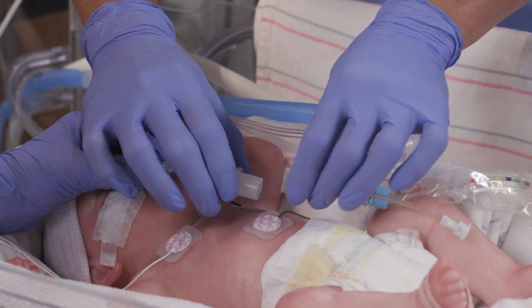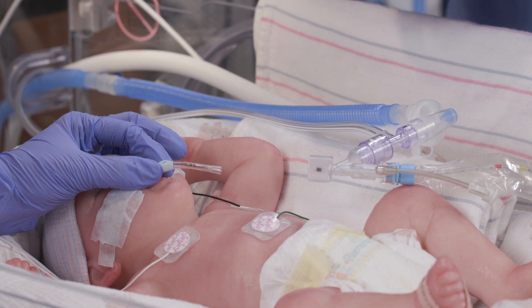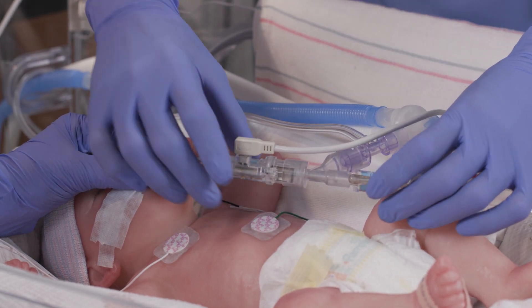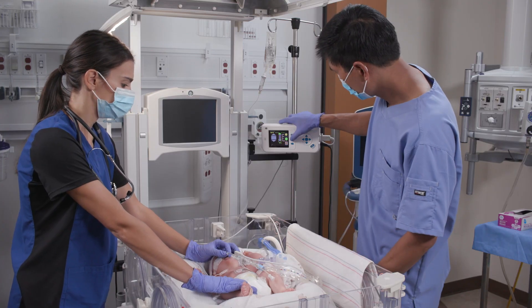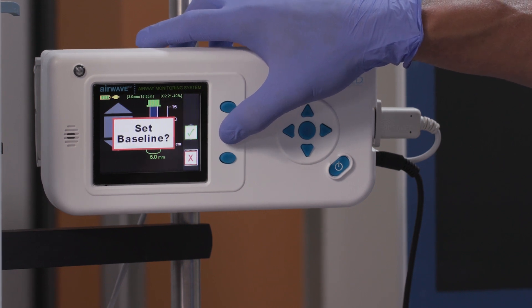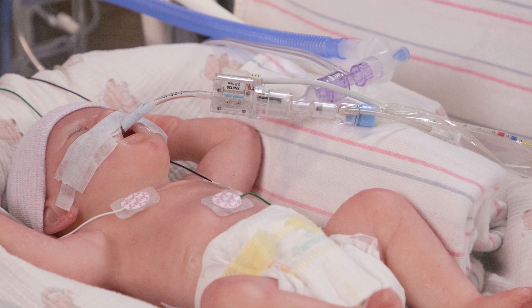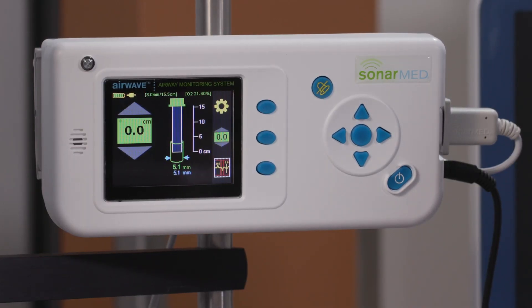During this process, you will be guided through your sensor calibration and setting confirmations. Once the sensor is calibrated, remove the 15 mm adapter or the inline suction Y and replace it with the SonarMed sensor and Y connector. Close the circuit to continue ventilation to the patient. The monitor will now recognize the connection to the specific ETT selected. It is now time to set your baseline location on the monitor, at the most optimal location within the trachea. Once set, your device will start continuous monitoring and your setup is complete.